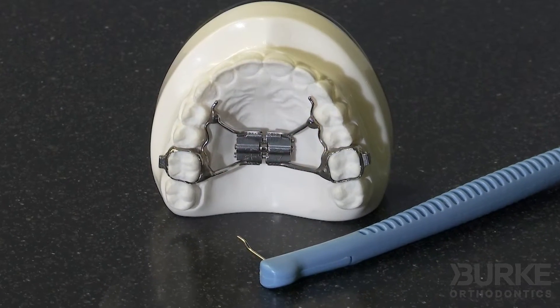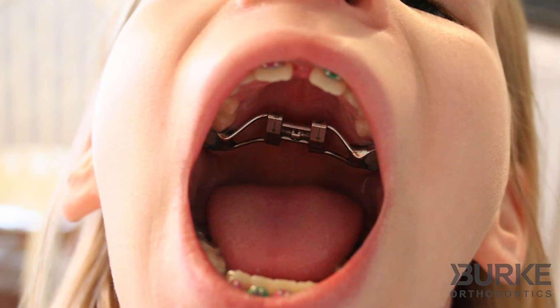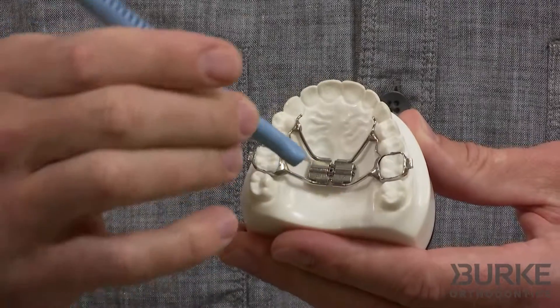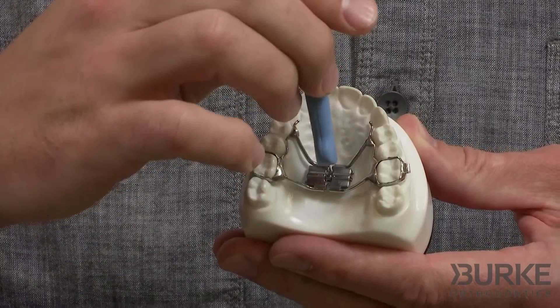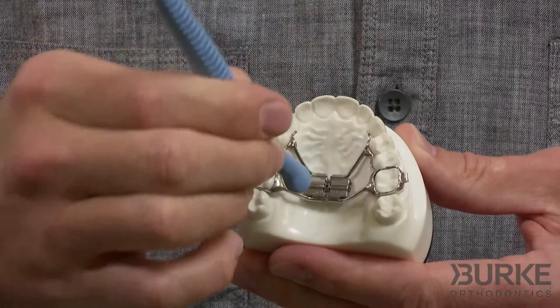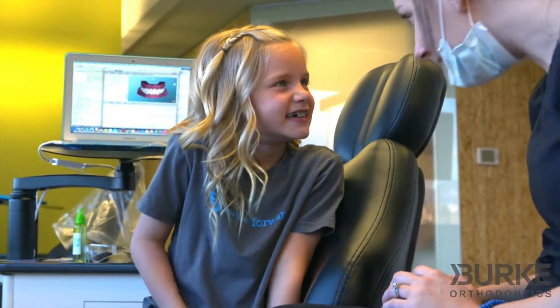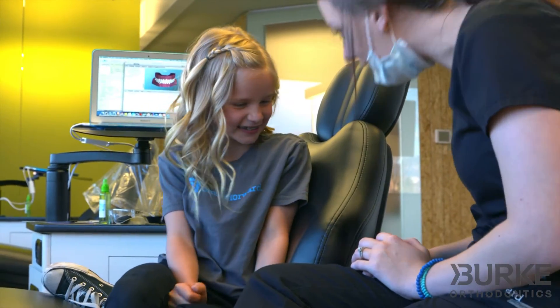An expander is a small orthodontic appliance that is custom-made in our lab so that its fit is perfect. It is then attached to the upper arch by bands placed around the molars, and it has a turning device in the middle that is turned with a special key. We will show a parent or guardian how to turn the key and how many turns to do. Each turn of the key will very gently expand the upper jaw to accomplish the treatment goal.